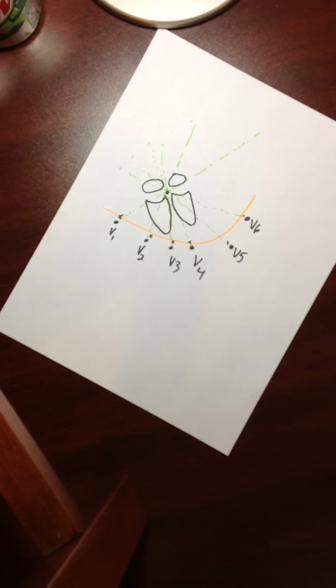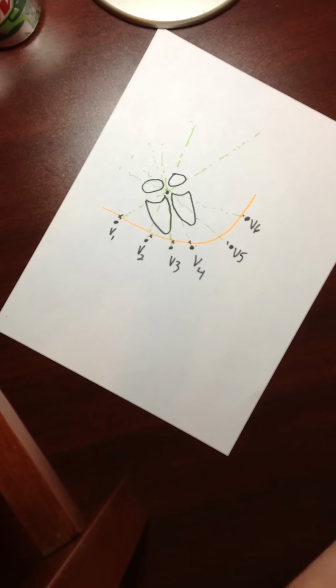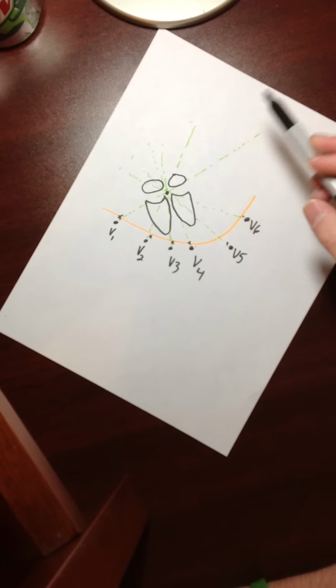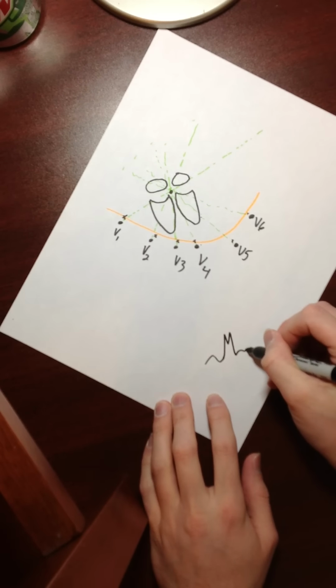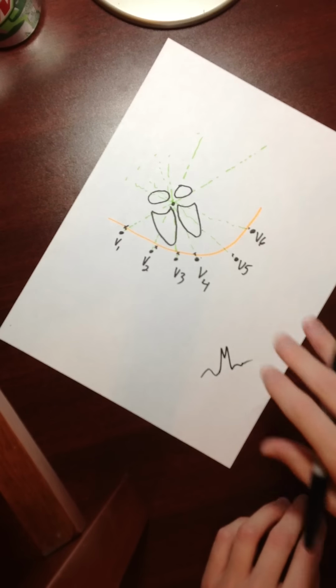So when you look at your arrhythmias, you'll see like a left bundle block and right bundle block. Well, I don't think he notes this in his packet, but a quick thing online, or if you read this book here, they kind of talk about it. You'll notice that for left bundle block, you'll see some things going on in V5 and V6, whereas in V1 and V2, actually, it'll look like this, where you have like an R and R prime. It's really kind of funky looking. So that's what's going on with this.